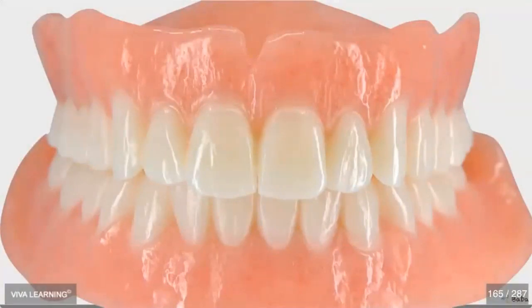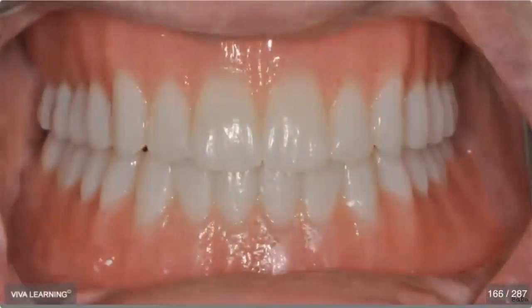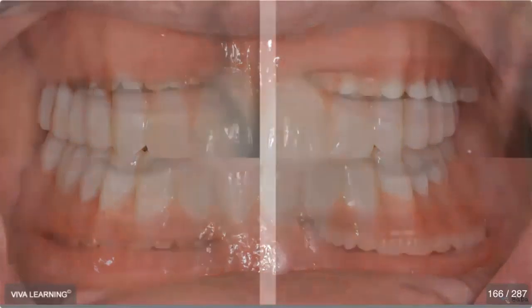So I call Lee and I have him finalize my dentures. Then once they're done, the patient comes back, and then we deliver it. Now at this stage, again, traditional PIP, paste application, check the bases, check the occlusion, and then if there's nothing needed, that's fine. And then hygiene instruction and maintenance.